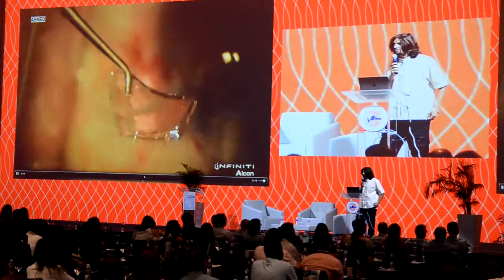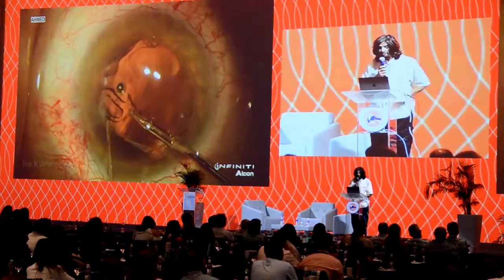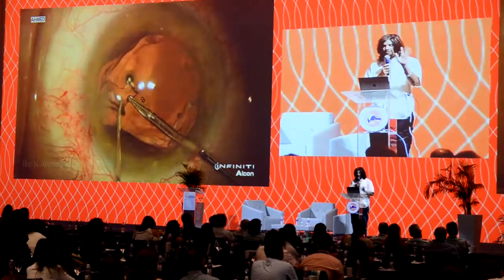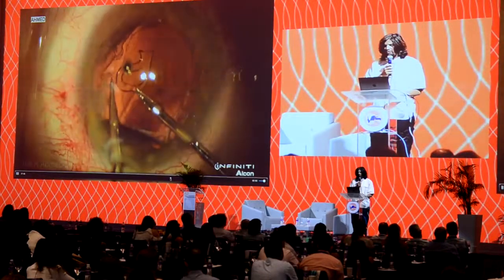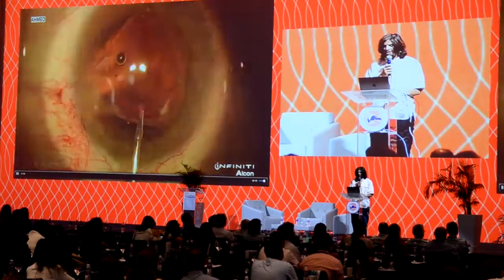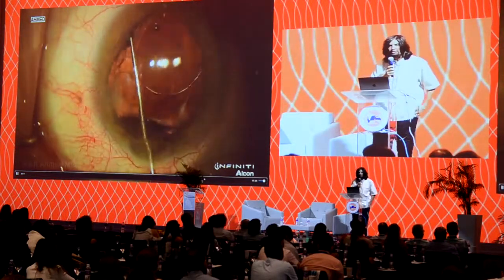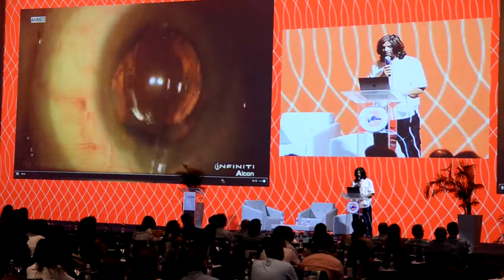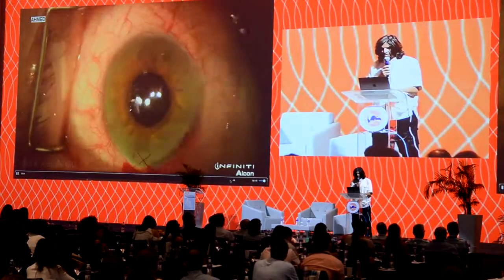You can see the calcification within the actual lens itself, and then I'm actually able to carefully dissect. Now I could have left it in there. I'm a bit obsessive again. We could leave it in there, and then we can basically remove that remaining haptic, as you see there. Place the three-piece lens into the sulcus, and then optic capture the lens in place. So that's basically a scenario there.